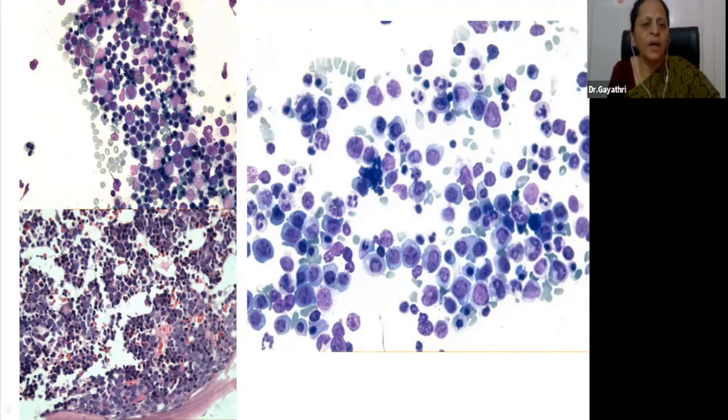Erythroid prominence. All the dark nuclei here are erythroid cells. And look at them, what are they? They are all megaloblasts, a large number of megaloblasts. So this is megaloblastic anemia, and this is how the section looks. I showed you an acute leukemia in that case of Fanconi, acute leukemia transformation, where these cells are occupying a large portion of the marrow.